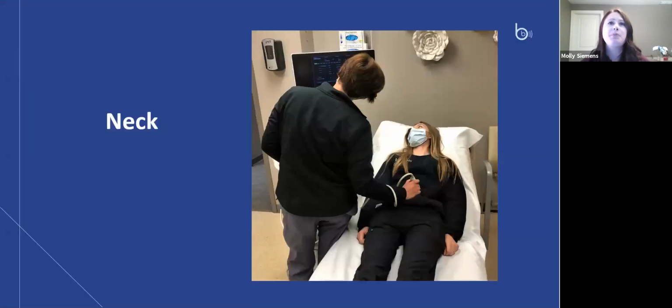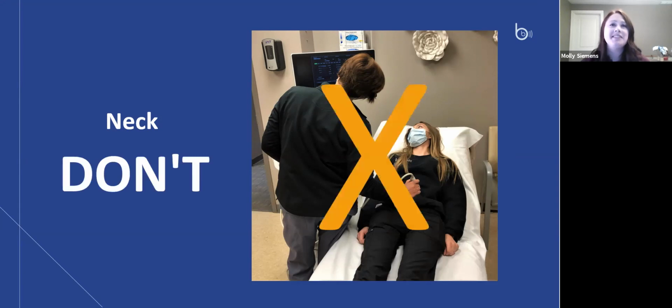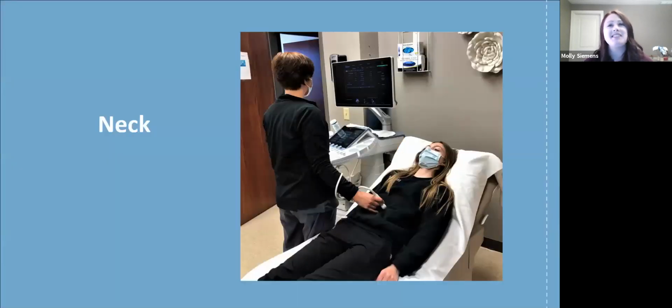Another abnormal posture is demonstrated here, turning our head in order to be able to see the screen at the same time as the patient. Obviously, the best remedy for that is to make sure that, again, the monitor is at an appropriate height for your eyes and having the screen turned so that it is facing you.